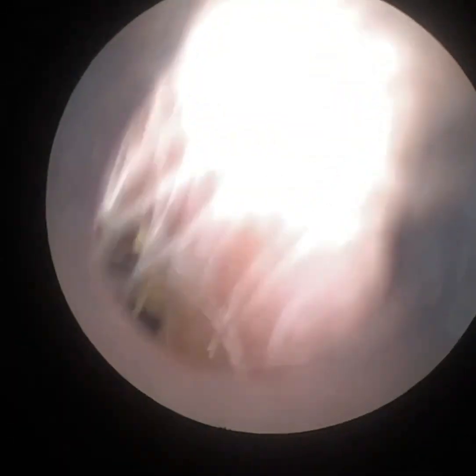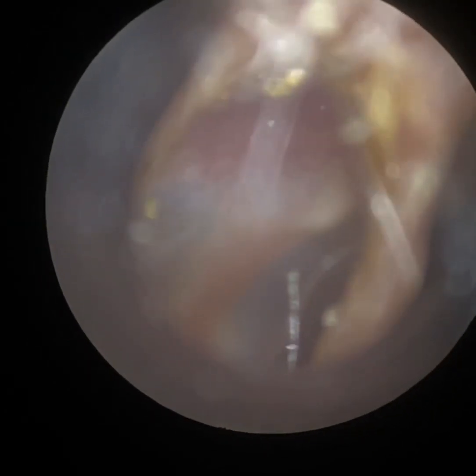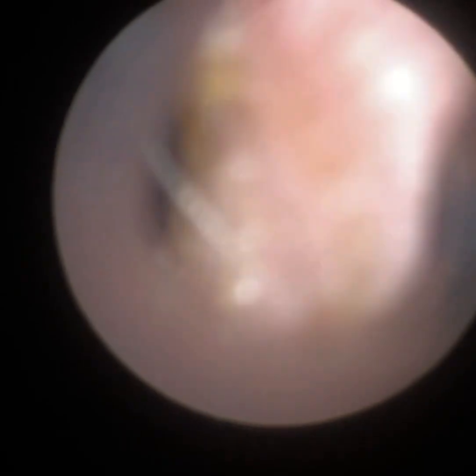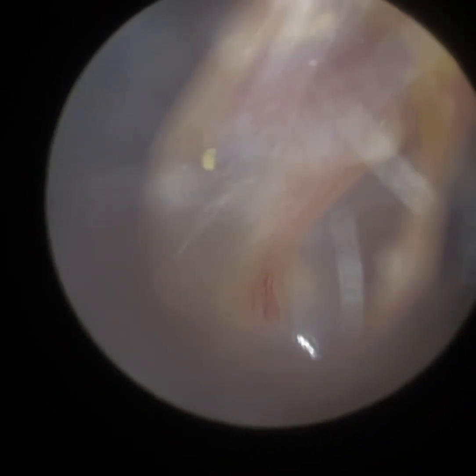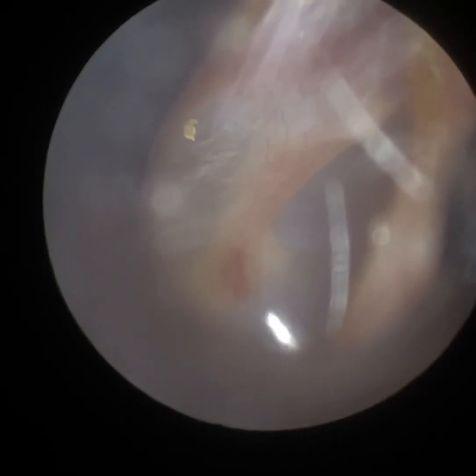It's just a bit of skin that's being a bit stubborn — you can see it's quite reflective, as dead skin is. So I'm just going to stretch the ear open as much as possible. Nonetheless, we can adjust the focus, and we've got a good view of the eardrum there. You can see the blood vessels supplying the nutrients of blood and oxygen to the hammer bone. And I can even see the light reflex there. So really happy with that.